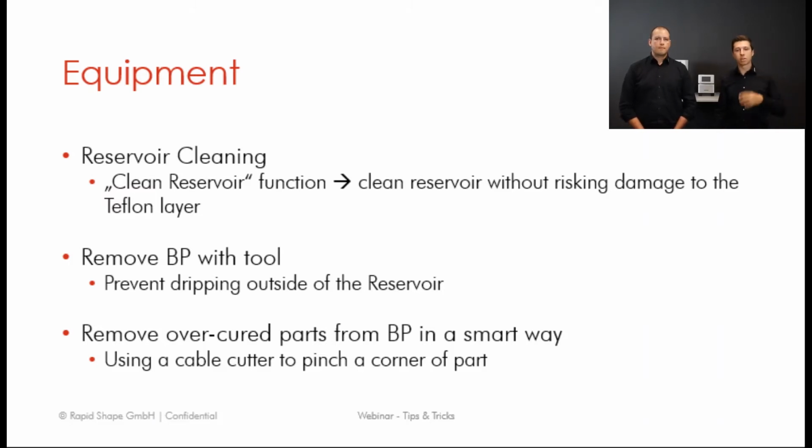Yes, there might be a chance that you will have got a failed job. Could be a wrong design, could be just that the printer is failing. Doesn't matter, but you got some failed job, and the next thing you have to do is clean the reservoir. Of course, you got also some residues sometimes in the reservoir or directly on the Teflon foil, and it's hard to remove them piece by piece. And especially the Teflon foil might be attacked if you just grab it with your fingers or with some metal tool and so on. To make these things easier, you can use the clean reservoir function.